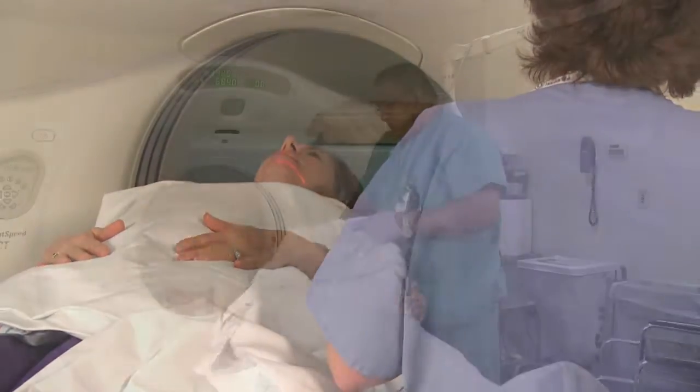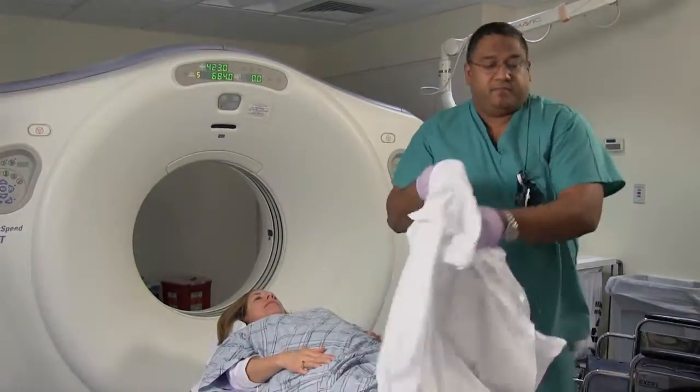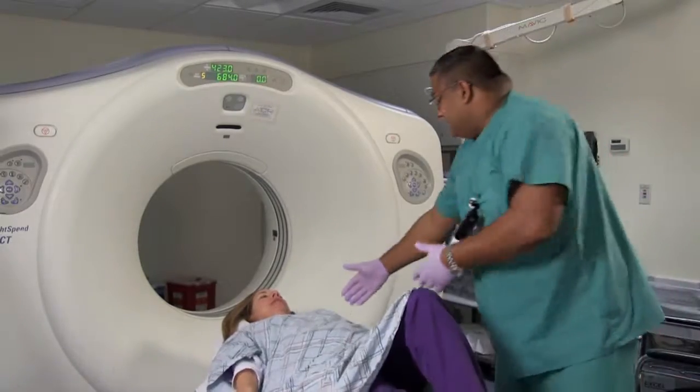When your CT scan is over, you will be taken back to your room, again using either a wheelchair or stretcher.